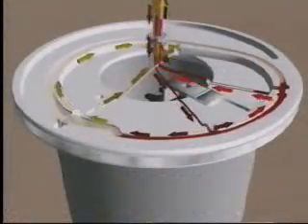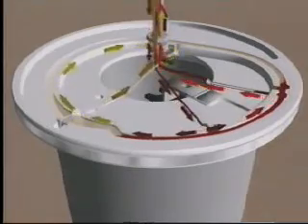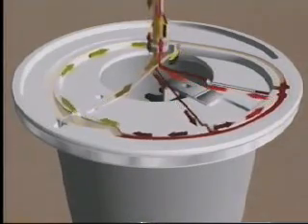The number of packed red cells in the channel determines the height of the PBSC interface relative to the particle separation dam that separates the first and second stages. During accumulation, the lighter plasma and platelets flow over the dam and exit the channel via the collect line and plasma line. The platelets and plasma are recombined with packed red blood cells and returned to the patient or donor.